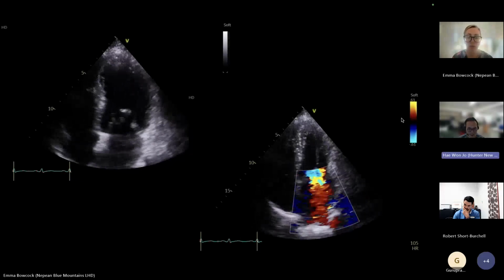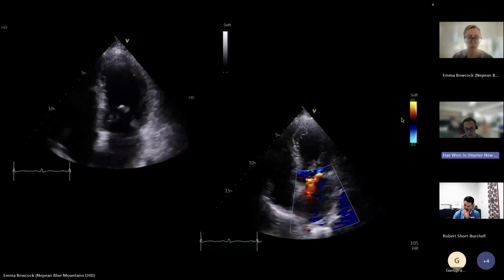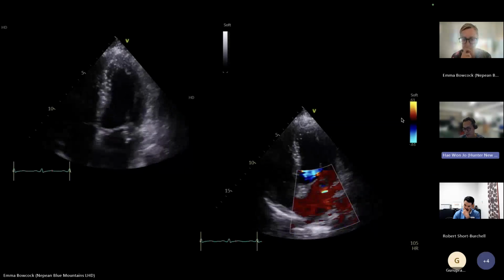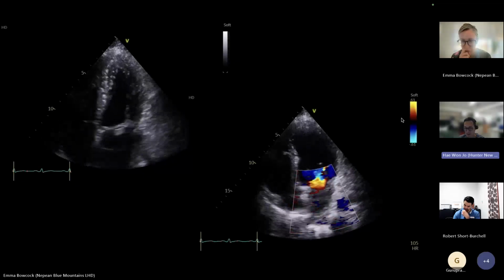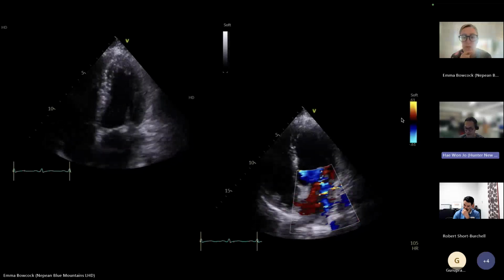So again, a large echogenic mass in the atrial, upstream portion of the valve. And on the color Doppler, I think there are multiple MR jets, which can occur with infective endocarditis. I'd like to also look at TOE images if they're available.